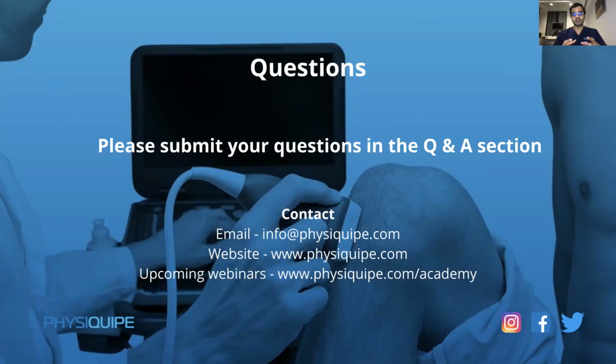And I find that ultrasound is quite a useful adjunct as a dynamic study to then moving on and doing an MRI scan as well, which gives us more information that an ultrasound may not. For example, looking at the bone marrow and looking for any bone marrow edema, and looking at all the structures together in terms of, is there a bigger picture going on here, and that I can then put into my report.